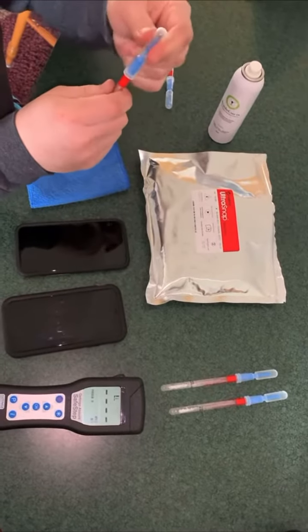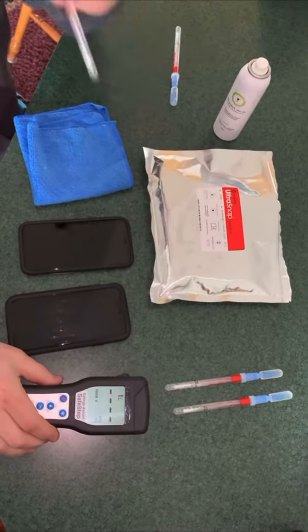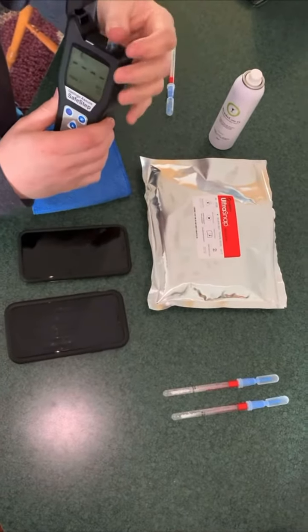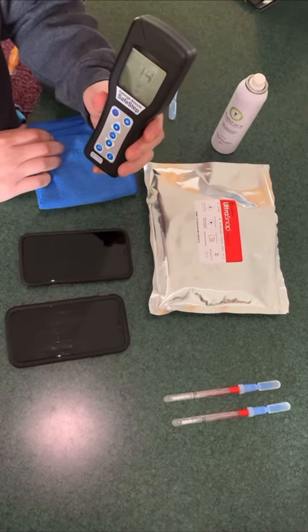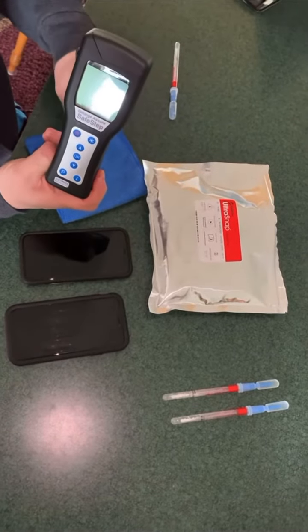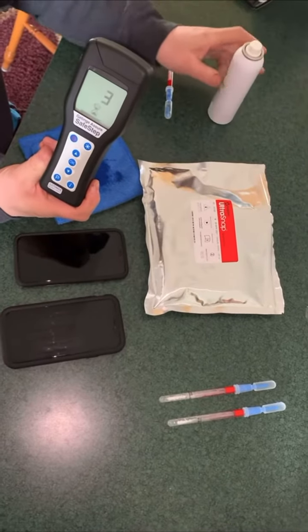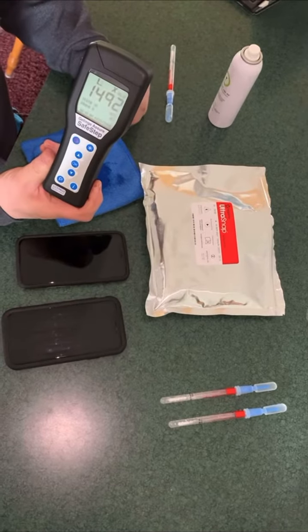Snap the top again, bring the fluid down, shake the fluid, put it in solution, and open the meter up. Drop this specimen in the meter. While that's counting down, I'm going to wet a rag with MicrobeCare. Let's see what Braden's number is — and 1,492.